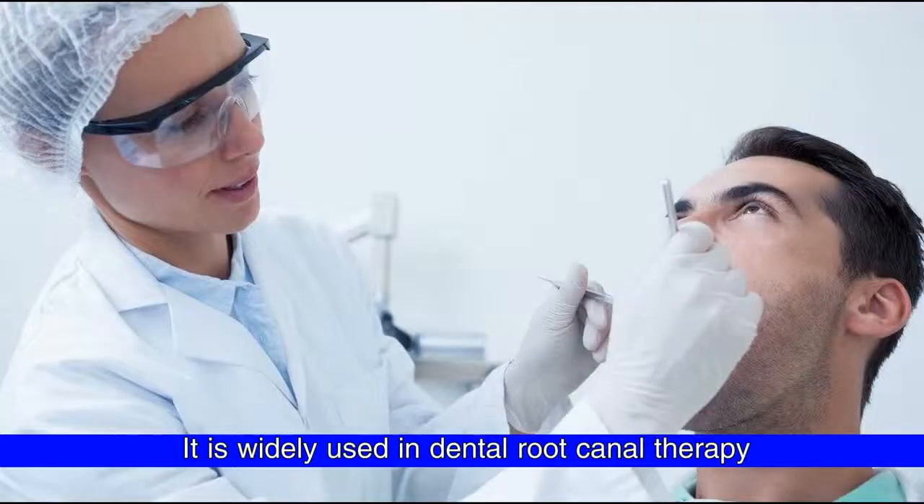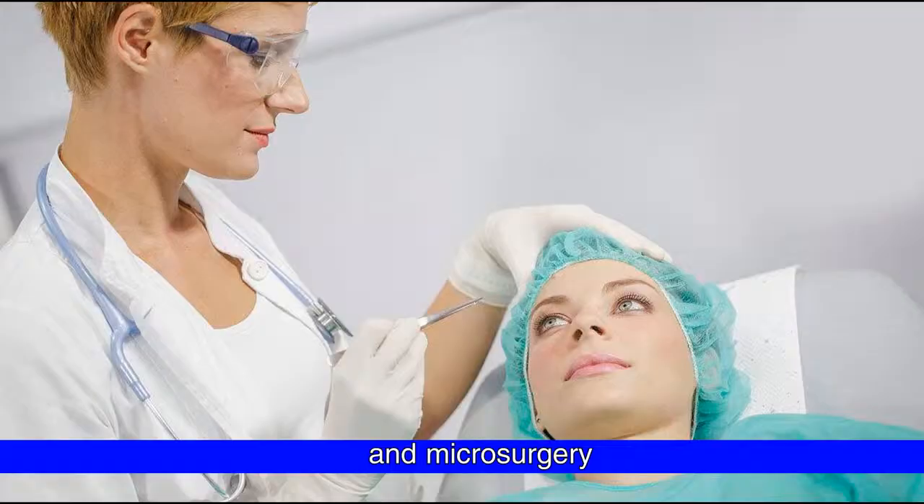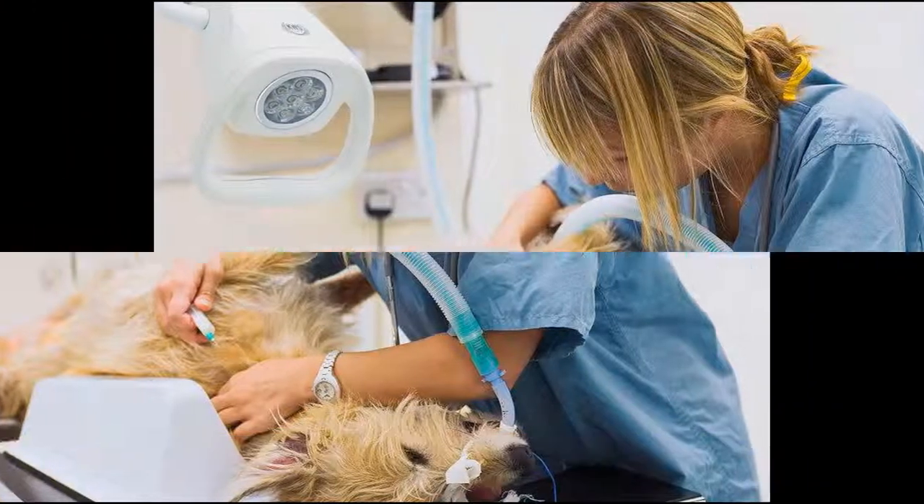It is widely used in dental root canal therapy, gynecological examination, tattoo, and microsurgery. It is also suitable for medical operations on pets and animals.